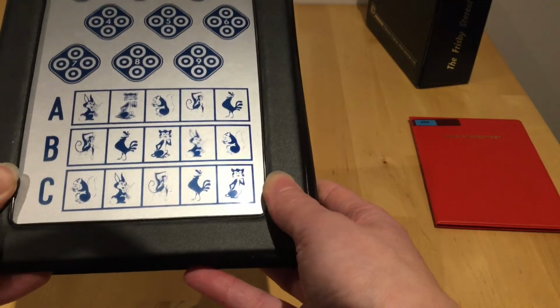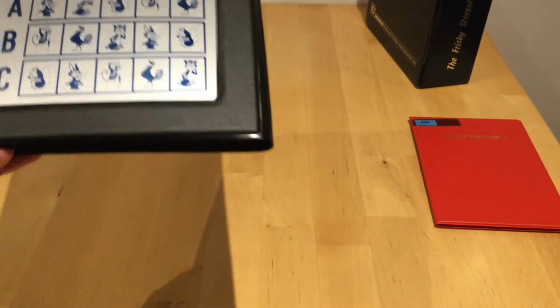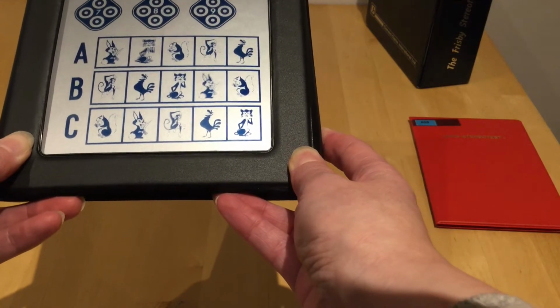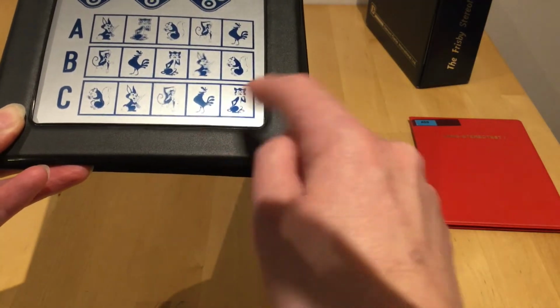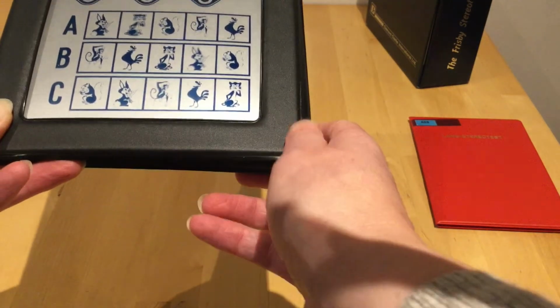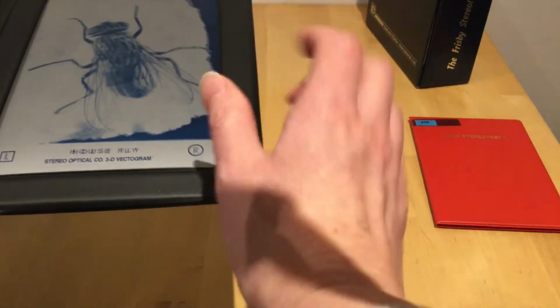And the rest have also got circles standing out, but less obviously. And again, in this part at the bottom, we've got a row of animals, and which animal is standing out. So in A, it's the second one, it's a cat, and B, it's the rabbit here, and C, we've got the monkey at the bottom. So that is the Wirt fly stereo test, but generally it's just the fly part that we'd use, and asking the child to pinch the wings.